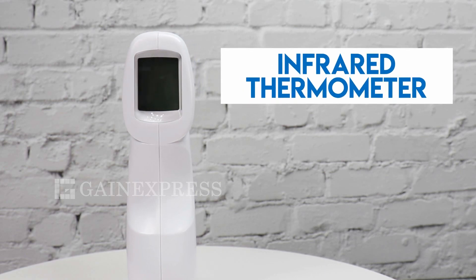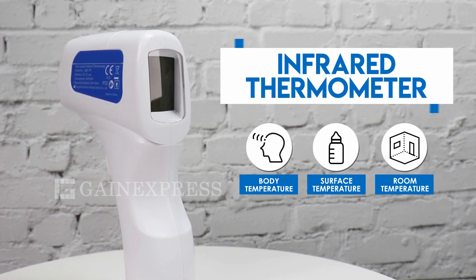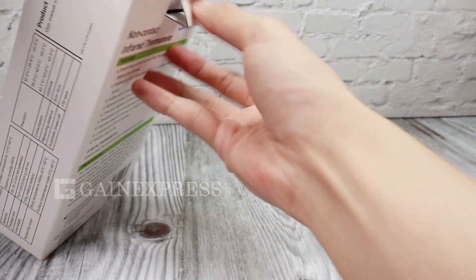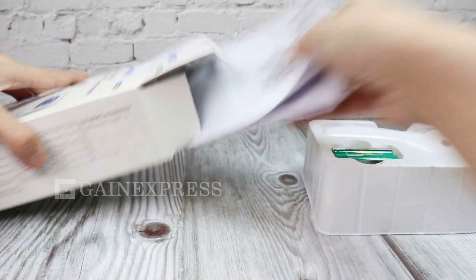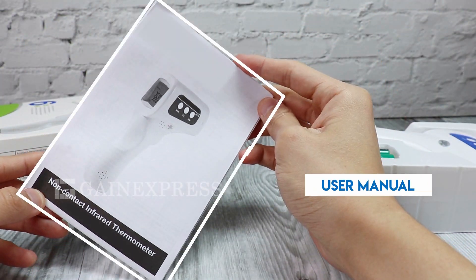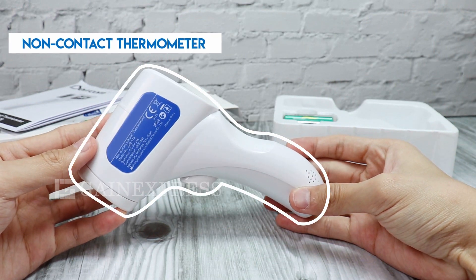This non-contact thermometer is intended to measure body, room, and surface temperature. Set includes our standard packaging, user manual, and the non-contact thermometer.